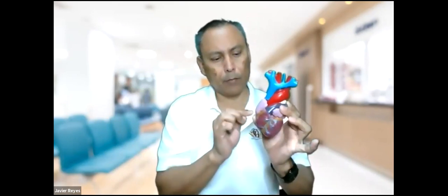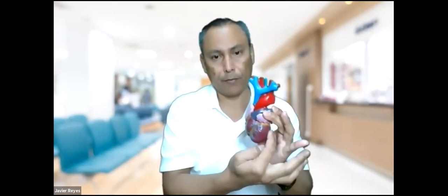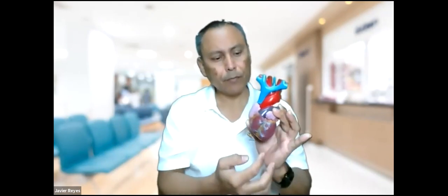And also you're going to have your chest leads, which look at the heart straight through. Okay, you have V1 through V6 looking at the heart from the center, right in the middle, and then to the left side, all the way to this part, where V6 would be located. So that's what you're going to be doing with a 12 lead EKG. Using 10 wires, you're going to create 12 pictures of the heart.